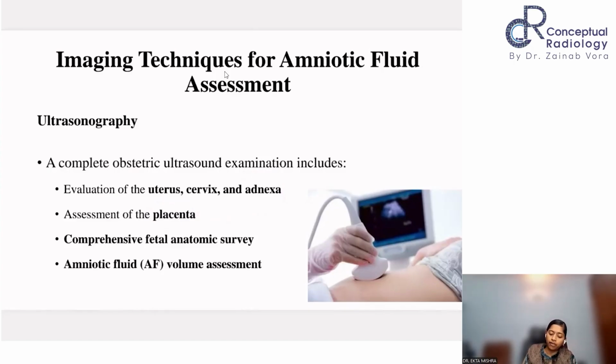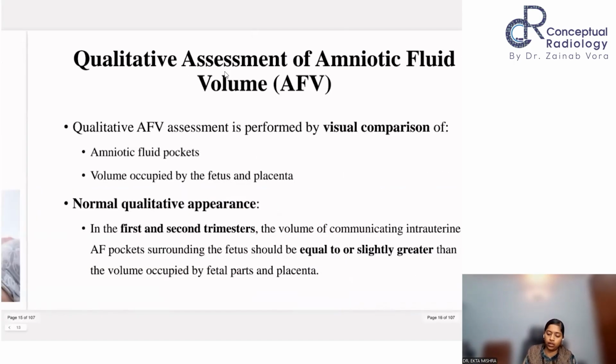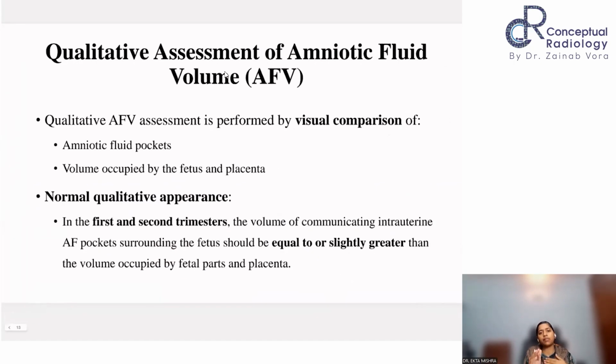And along with that, fetal anatomic survey, including morphology and growth, biometry, both need to be done in every scan. You look for the fluid. So fluid assessment can be done qualitatively and quantitatively. It's very important. You do it both ways.